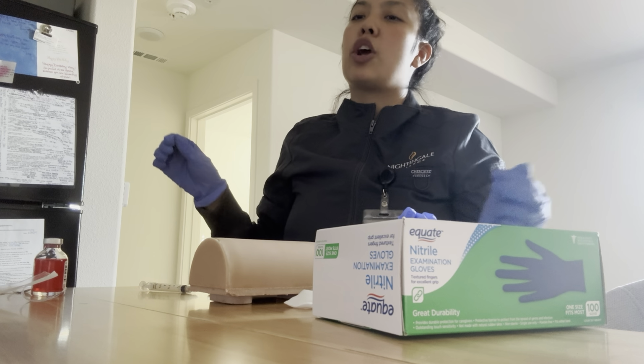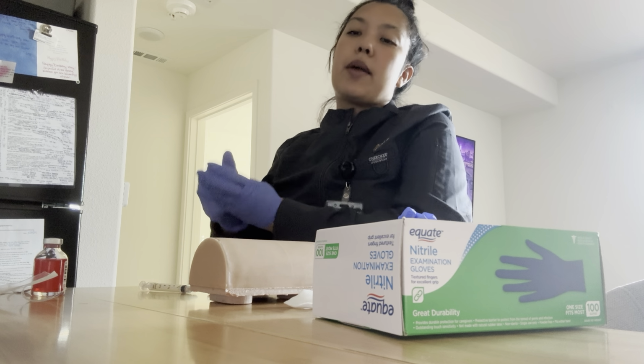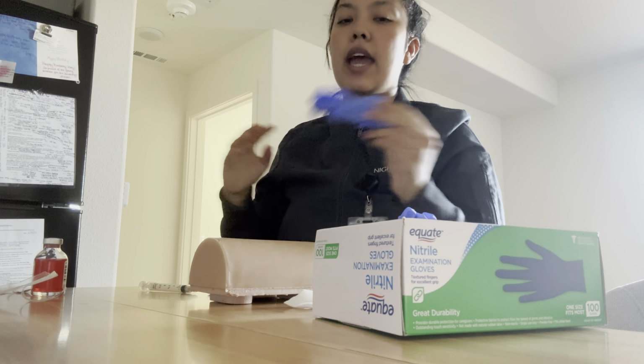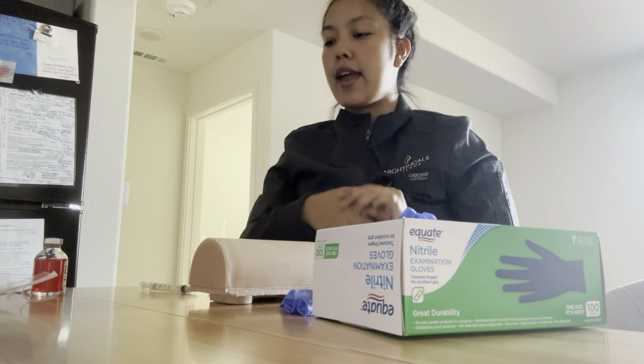I'm going to ask the patient, are you comfortable? I'm going to pick up all my supplies, and then I'm going to take off my gloves, hand hygiene and document the procedure, and good to go.